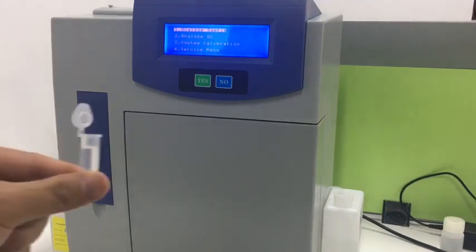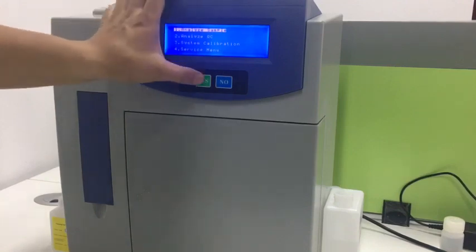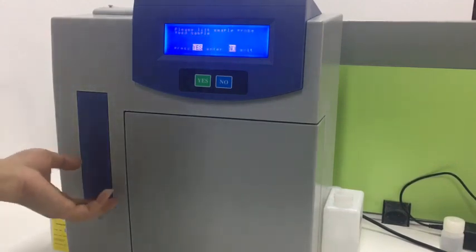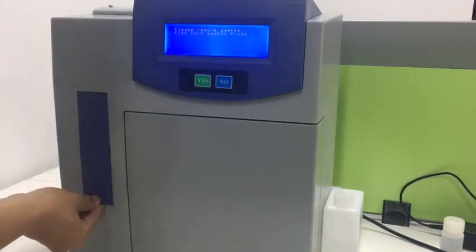Then we use the rest of the solution to run a test as a sample. We use the first function, 'Analyze Sample', and press 'Yes'. According to the prompt message, do the operations. We lift the sample probe and feed the solution, press 'Yes', and close the sample probe.